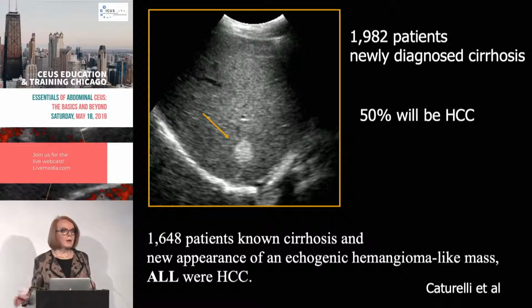Many years ago when I read this manuscript, I did a patient that we'd been scanning for years and never seen a thing, and we saw a new echogenic nodule in her liver. So I quoted the reference and I said, this is an HCC. Of course, about 5 minutes later, I have this doctor standing in my office saying, Stephanie, you must be going crazy. You can't tell it's an HCC on an ultrasound for sure.